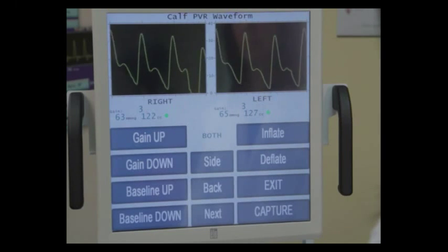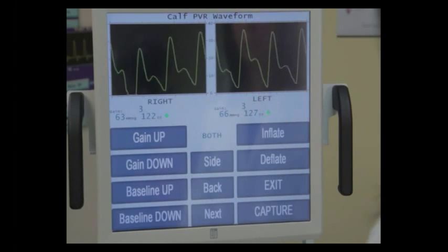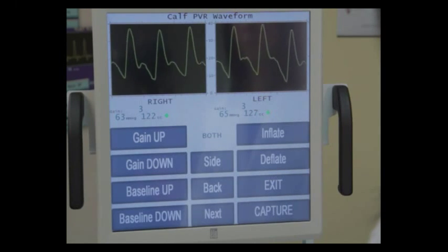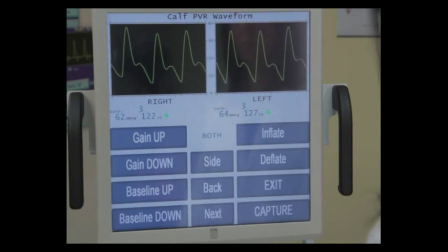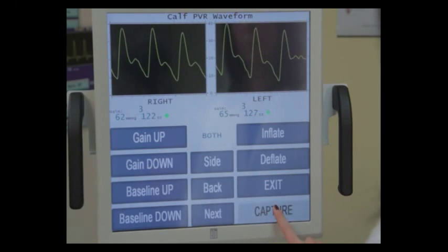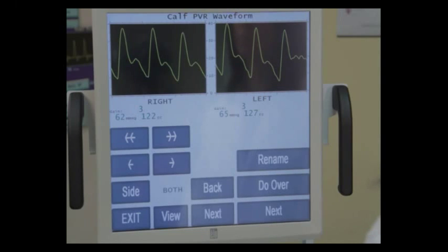You'll notice now that our calf waveform is completely on the screen. If we had not moved the gain down from 4 to 3, we would have been clipping off the tops and the bottoms. These look wonderful. Both lights are green, so we're going to capture. We're going to scroll the left one back independently.